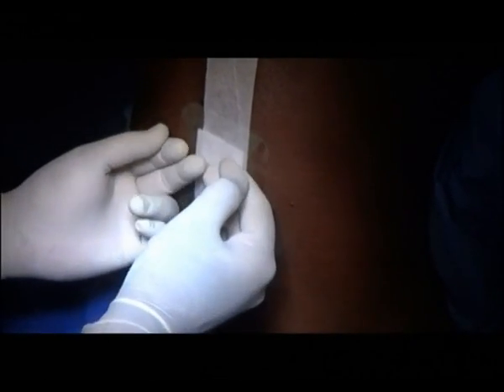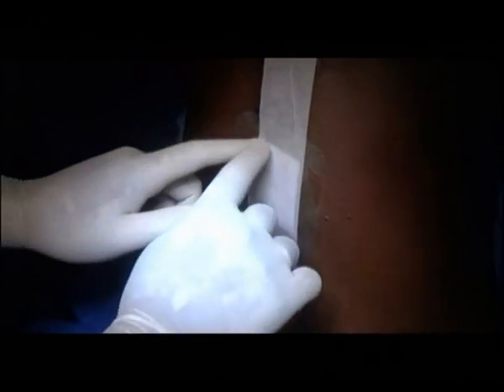See, what I do is, even when I fix a catheter, the same tegaderm without the plastic, I try to fix the catheter more closely to the skin, like this, so that it does not exit. What I personally feel is, suppose you have this type of gauze here, this is what is going to give the tensile strength to fix the catheter. Here the catheter is going to be loose only because it is not fixed to the skin at this level. So there is a possibility that this gauze becomes loose and the catheter can accidentally exit. I use the tegaderm without gauze and fix it directly to the skin here and then put in a plaster to fix the catheter. That is how I fix it regularly.